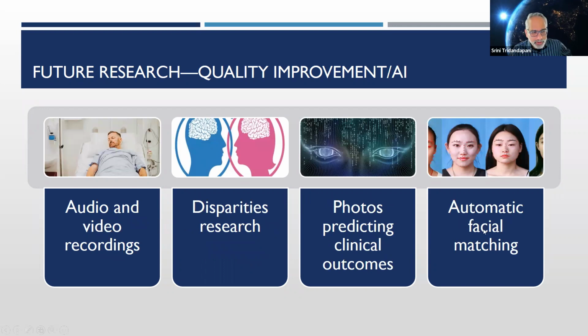So we started doing automatic facial recognition so we don't put the burden on the radiologist. We're actually getting audio and video recordings of the patient. So when they're taking the radiograph, we actually ask the patient, hey, why are you here? What's your chief complaint?